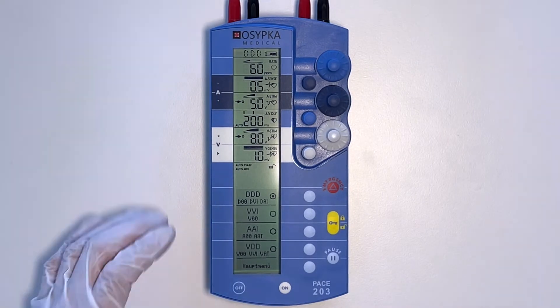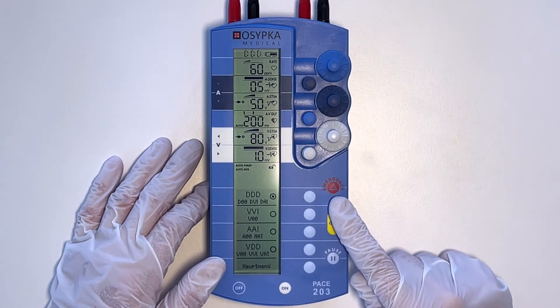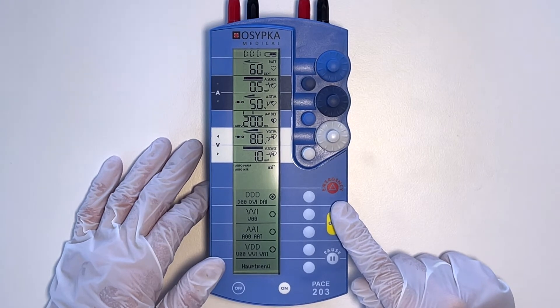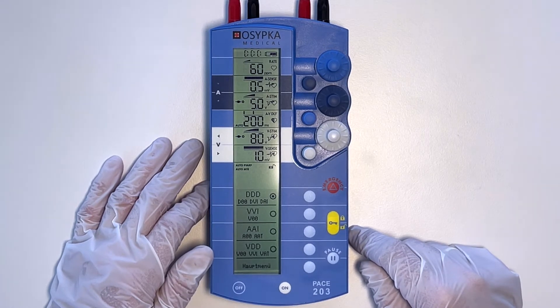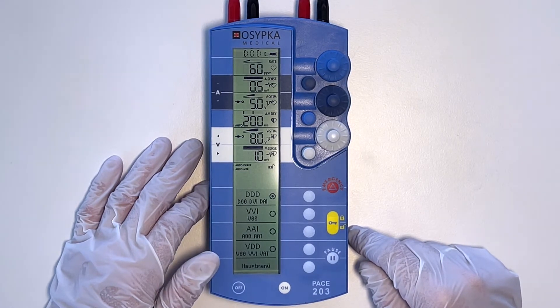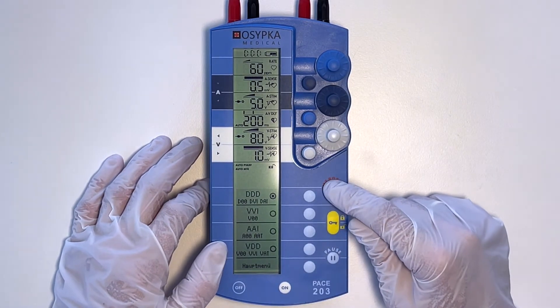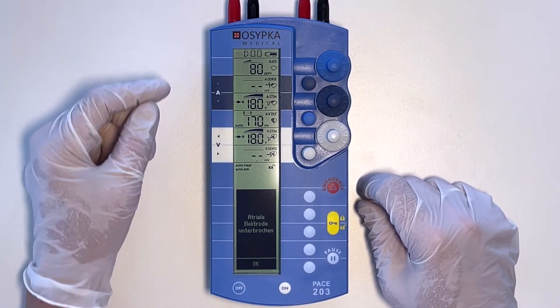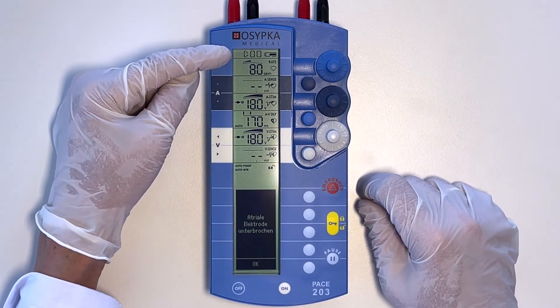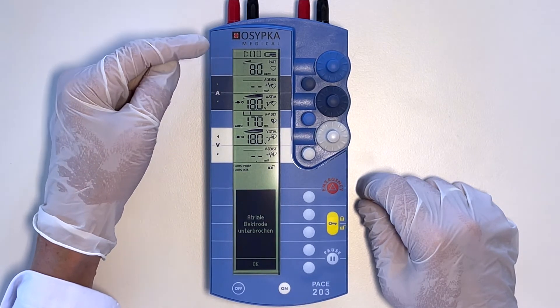The third thing to know is the red button. The red button is the emergency button and turns the device into asynchronous pacing with maximum output. You press the yellow button first, then the red emergency button. The PACE 203 will immediately go to DOO asynchronous pacing — there is no sensing in the atrium or the ventricle, and therefore no values are displayed. The device stimulates with a maximum output of 18 volts in the atrium as well as in the ventricle.